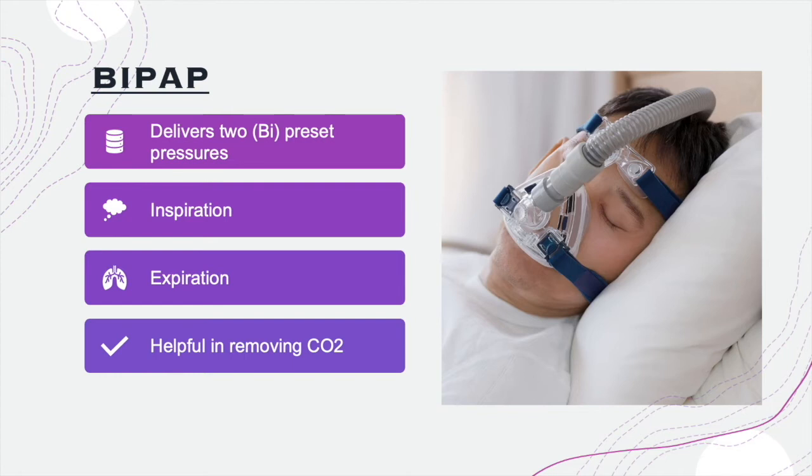So if there's a patient on a vent and we see a blood gas where there's a high carbon dioxide, we can pretty much increase the respiratory rate, thereby decreasing carbon dioxide. And the reverse holds true as well. If we see a low CO2 and a pH that is alkalotic and we want to bring it back down a little, we can slow the rate. And by slowing the rate, this is going to increase carbon dioxide because we're not releasing it, okay?